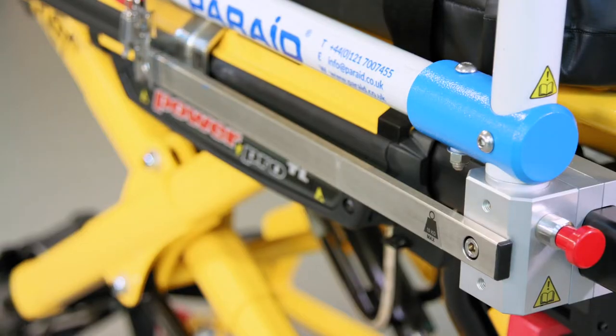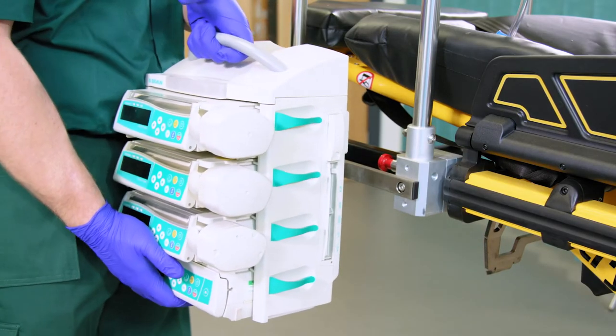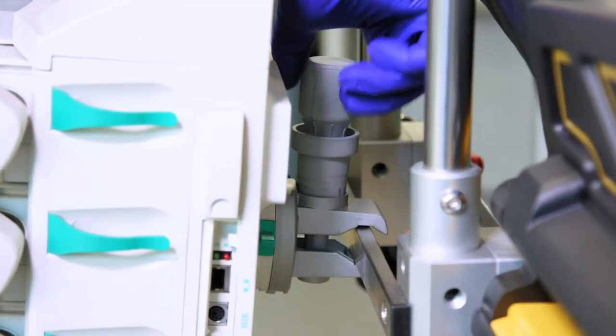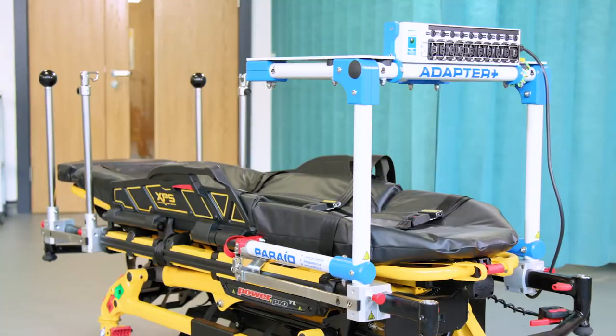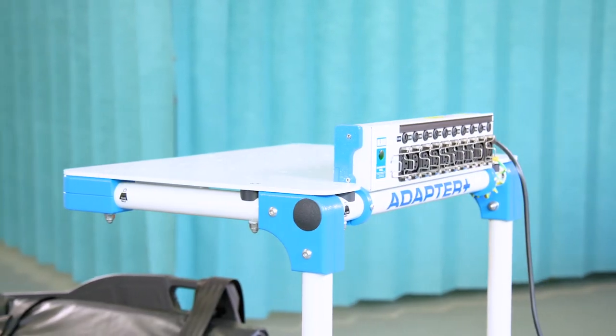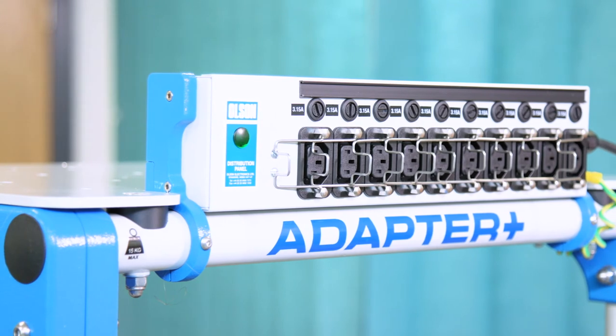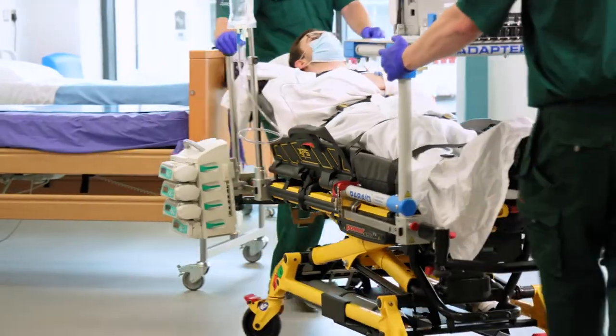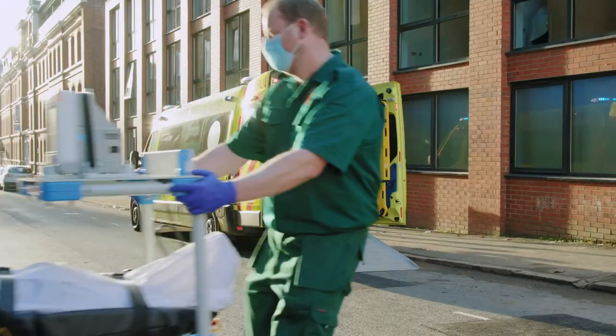The medi-rail and the medi-rail assembly attach at the head and the foot ends of the stretcher, securing vital equipment and providing easy access to paramedics. It enables a standard Stryker stretcher to carry critical care equipment, including ventilators, suction units and infusion pumps, to ensure the safe and comfortable transfer of the patient between hospitals.